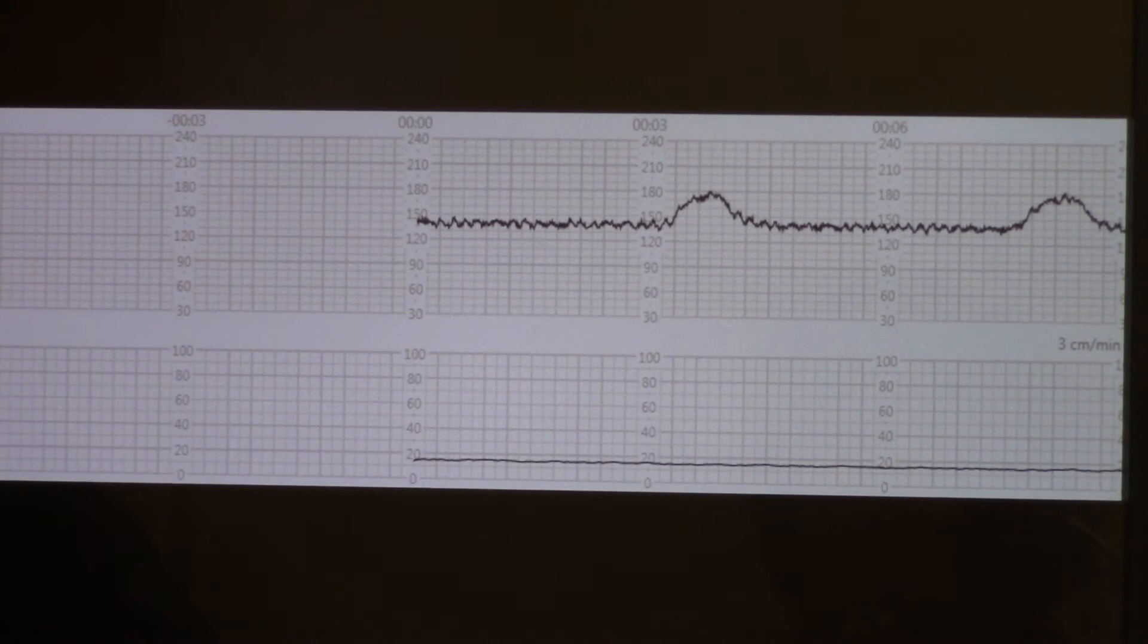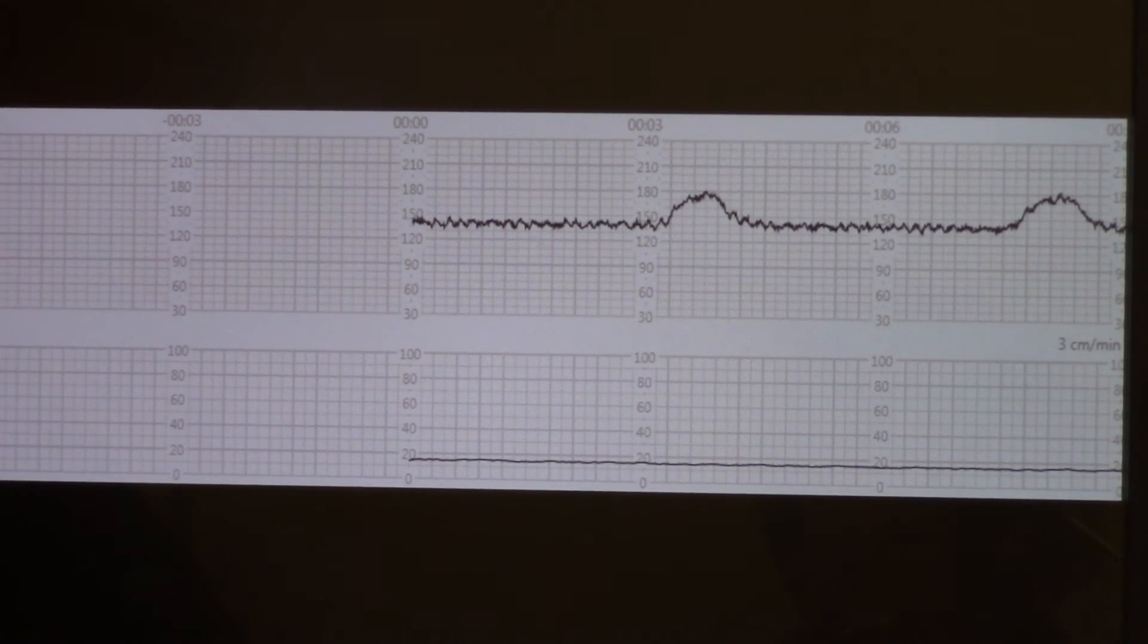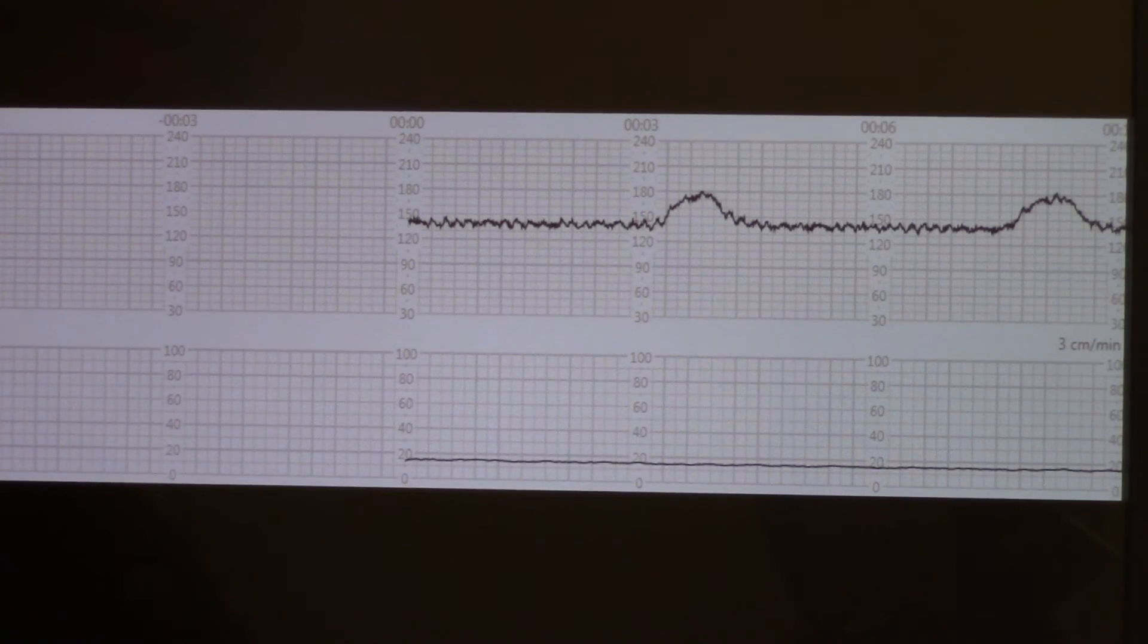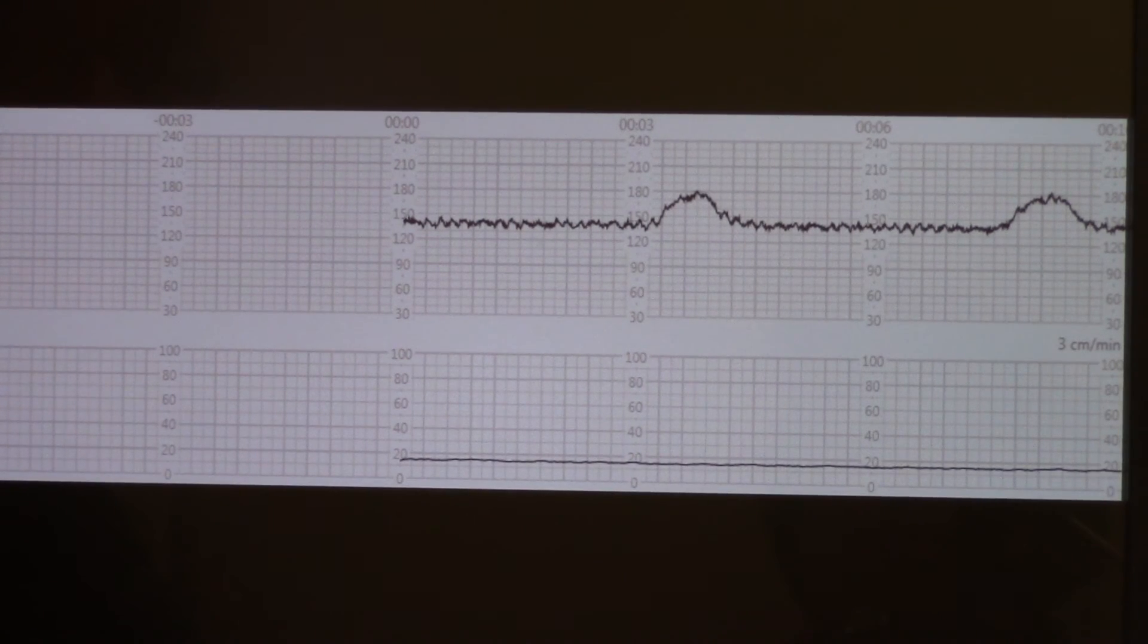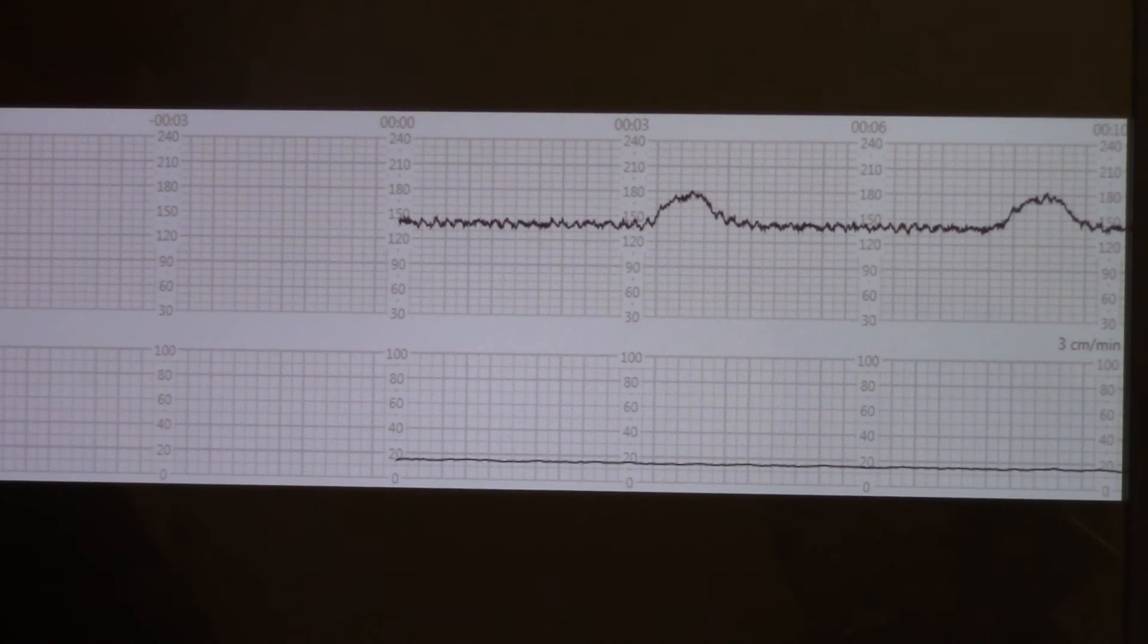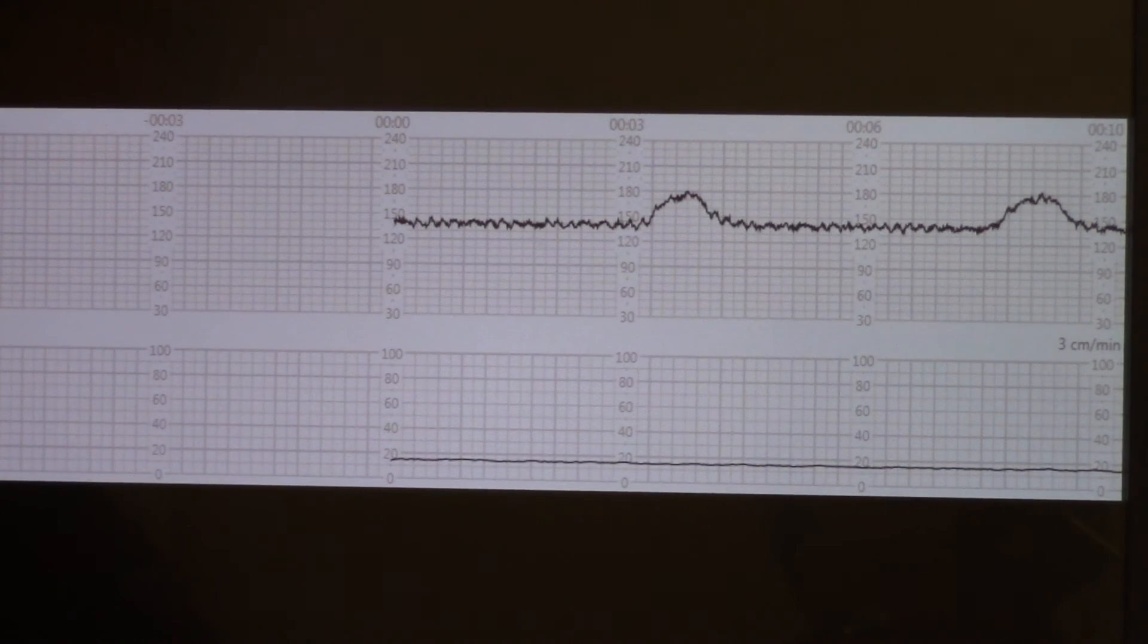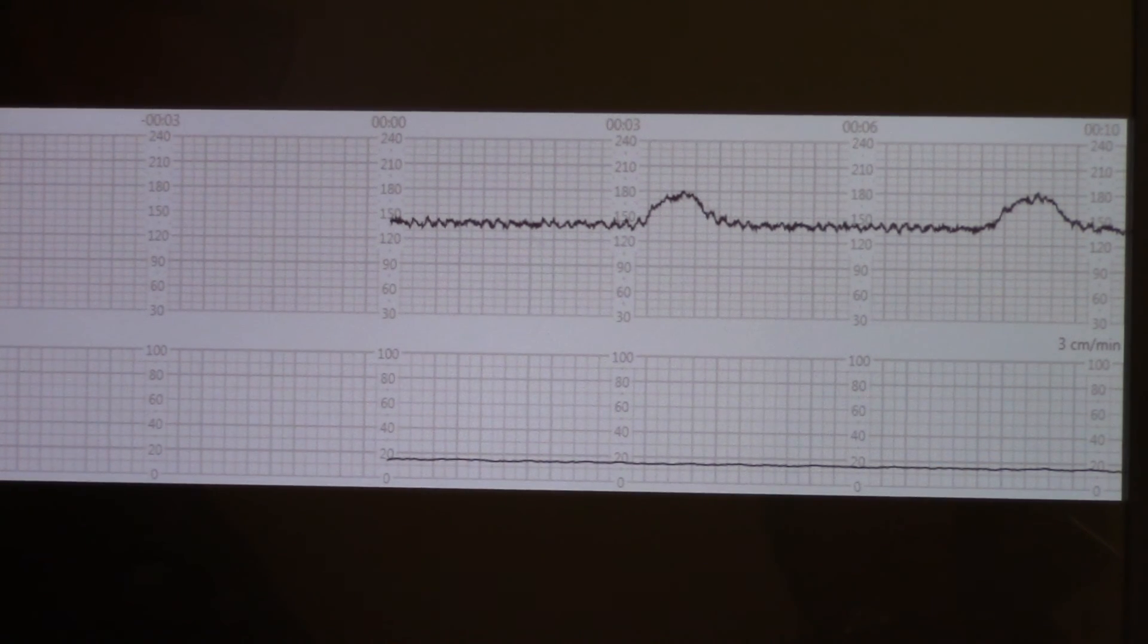Once again, a reactive non-stress test is two accelerations that meet criteria, which both of these did, and a 10 to 20 minute tracing. This is definitely within that timeline. You can see this is approximately 10 minutes here. You can see there's average variability, 6 to 25 beats variance in the heart rate, and there are no contractions.